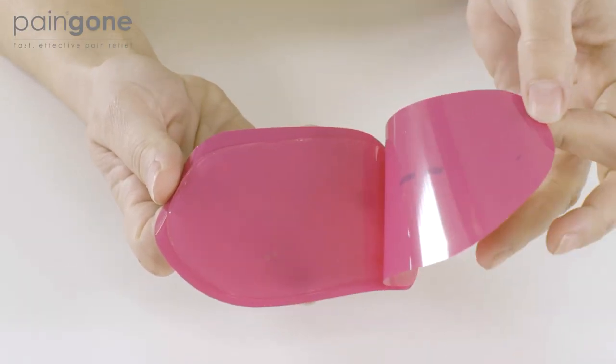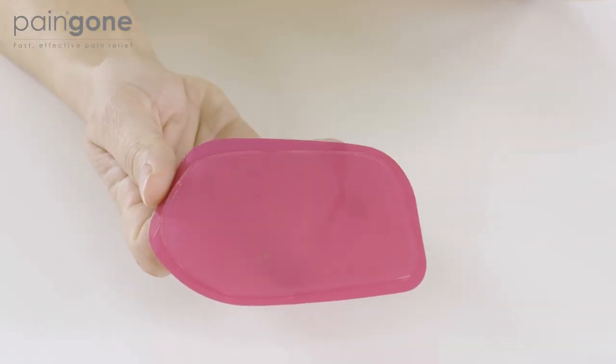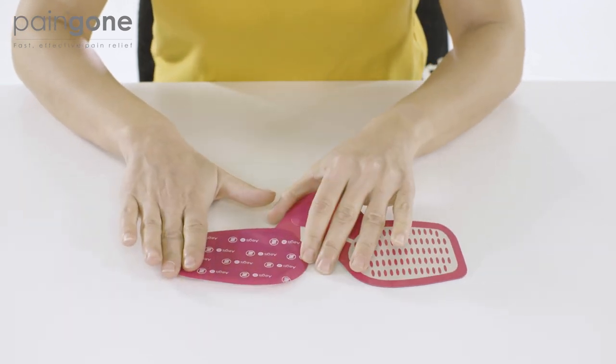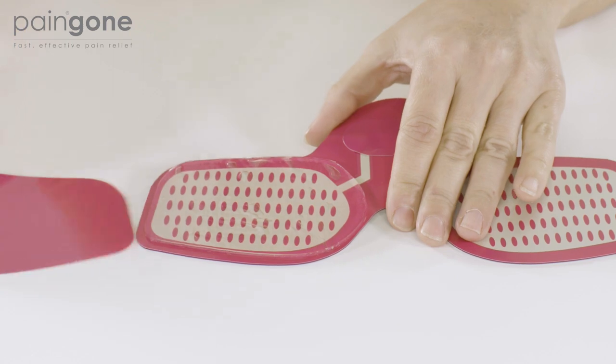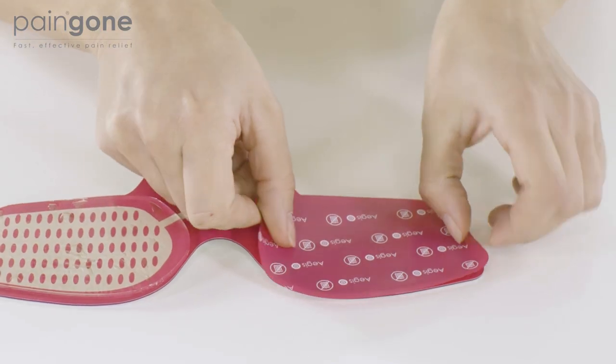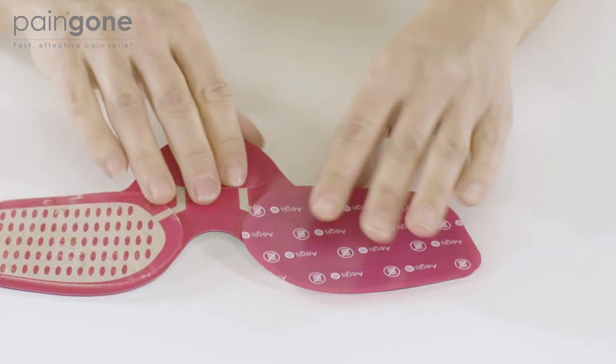Take one gel pad and remove the plastic cover with numbered diagrams illustrated on it. Apply the gel pad to the Aegis device. Now remove the plastic cover with the Aegis logo repeated on it. Retain this plastic cover for later. Repeat these same steps for the remaining gel pad.